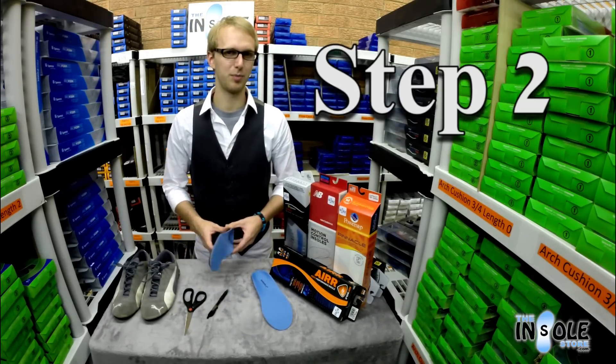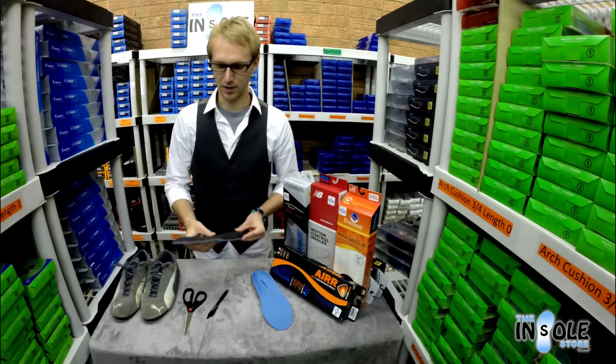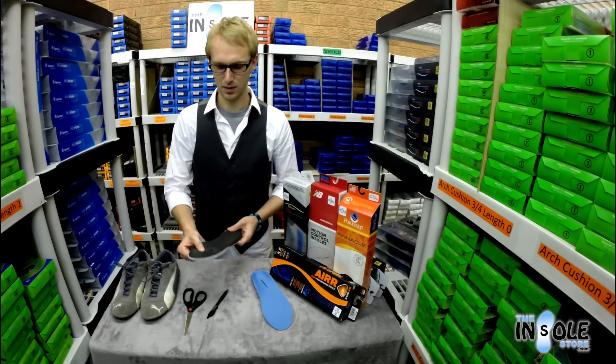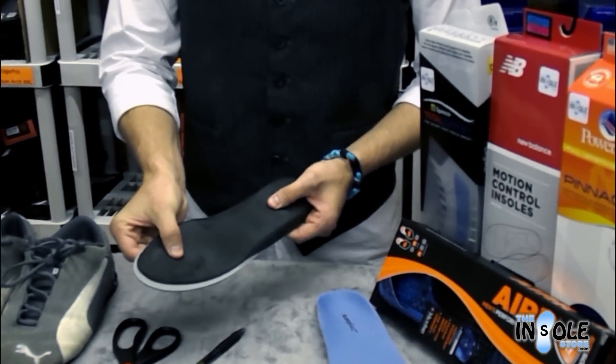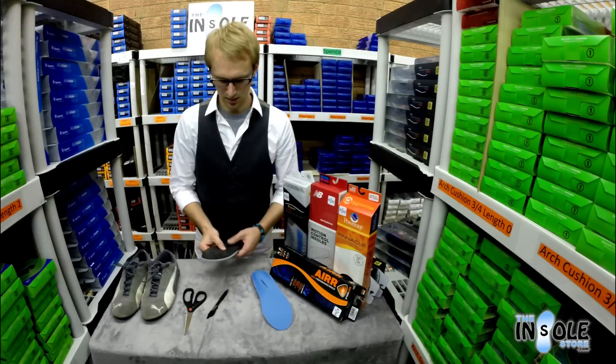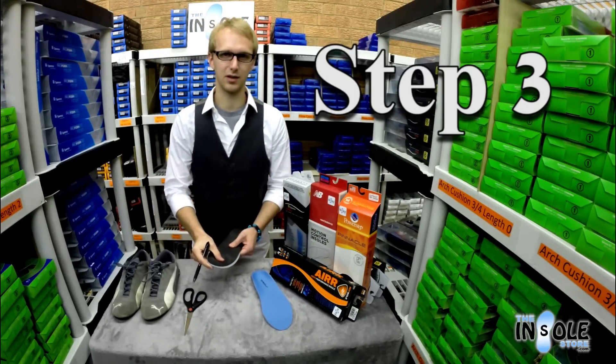We're going to take the corresponding full length insole you've just purchased and place the factory insole on top. Line up the heels and notice the excess in the forefoot of the insole. Now with a pen we're going to trace the excess.